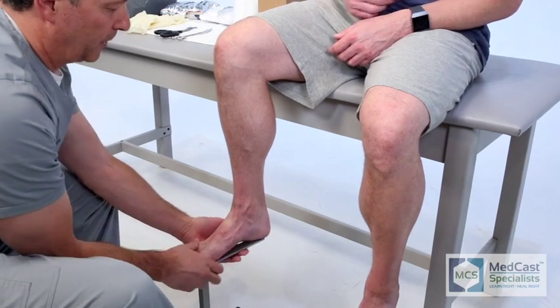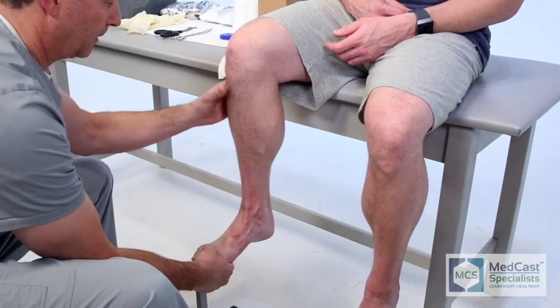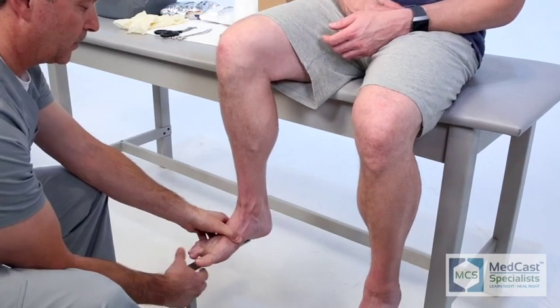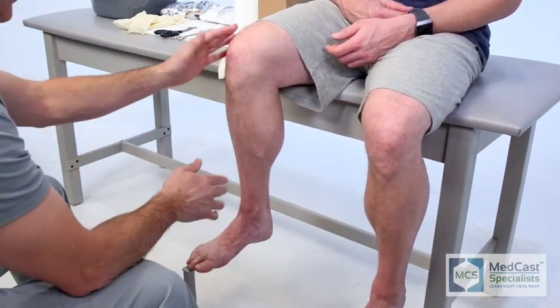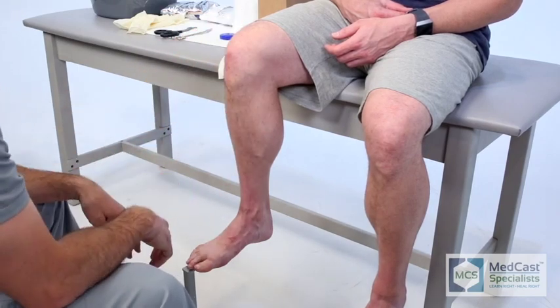We're putting the cast stand on and applying it. He has such a high arched foot that if you incorporate that across it, you'll have a nice bothersome air gap that you don't want, so cheat a little bit to the lateral side. If you're having a hard time getting them to 90 degrees, slide the foot back a little bit more posterior to the foot stand and put it more on the ball of their foot.